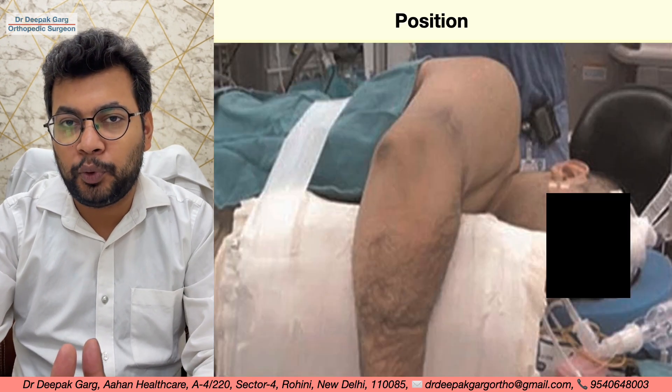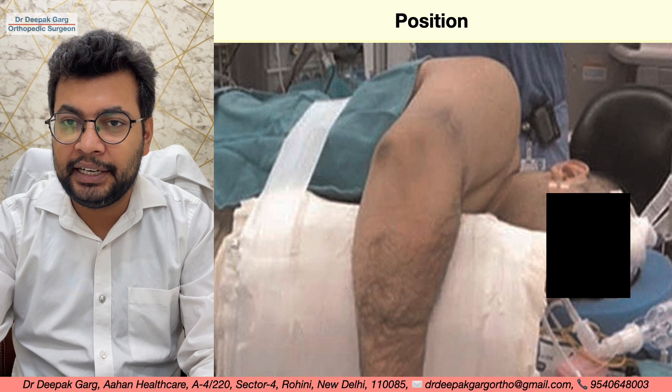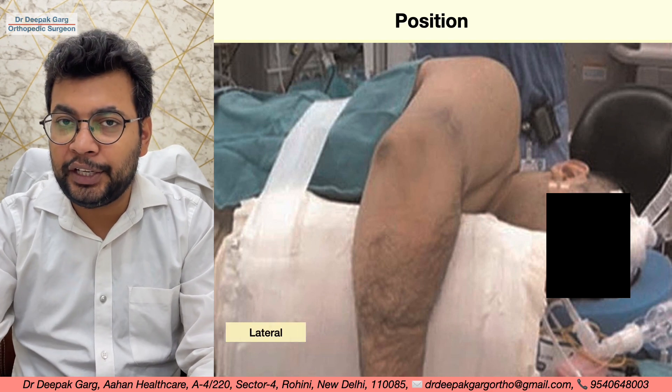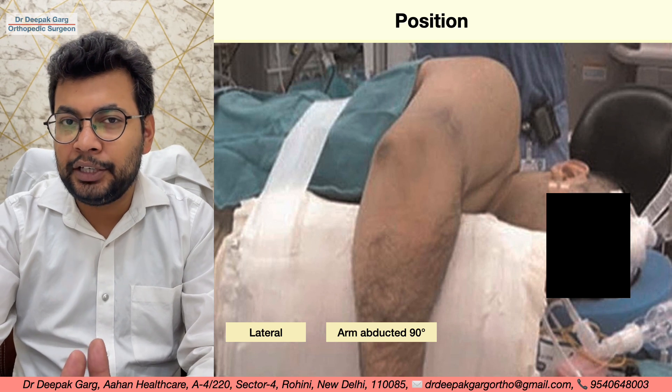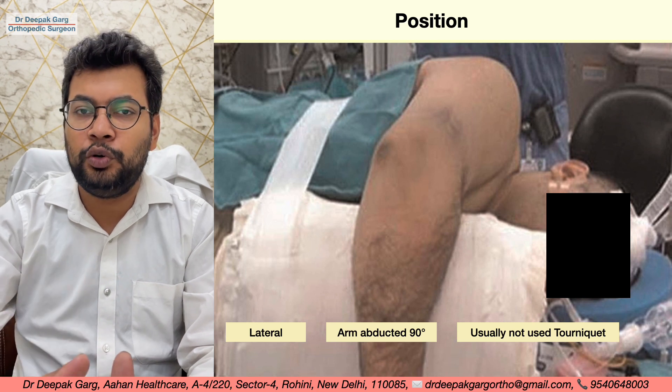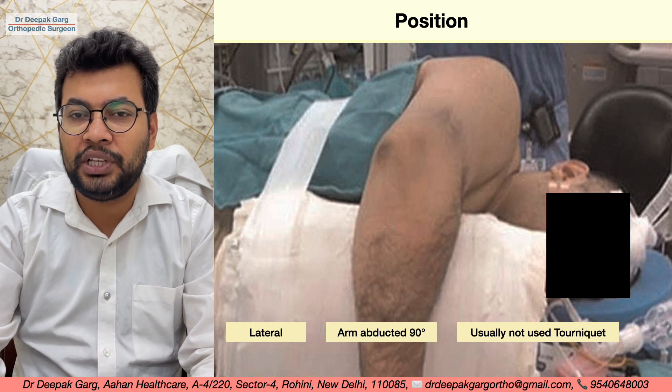In the posterior approach, we will keep the patient in lateral position. We will keep the arm in 90 degrees of abduction and usually we will not use the tourniquet because it will come in the way. If you want to work distally, sometimes we can use the tourniquet as well.